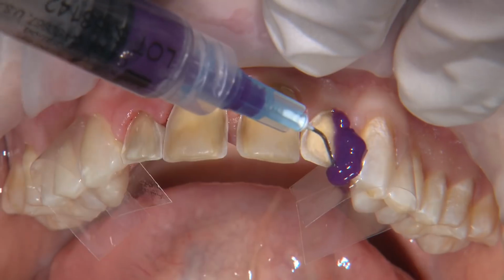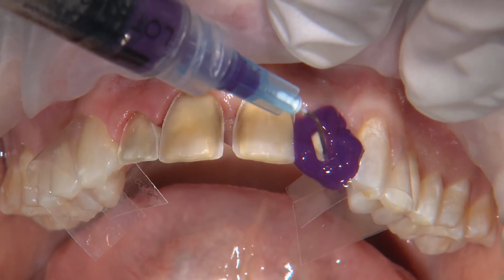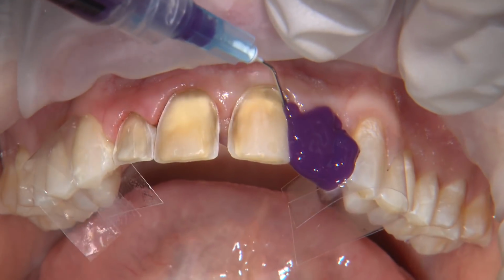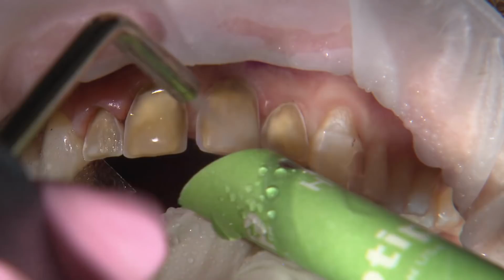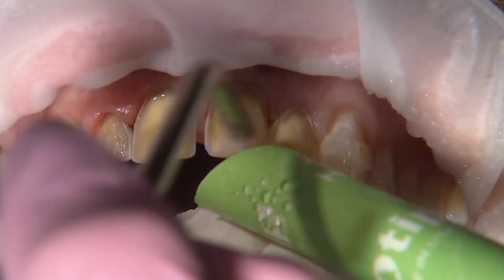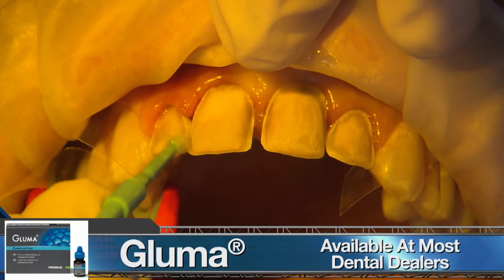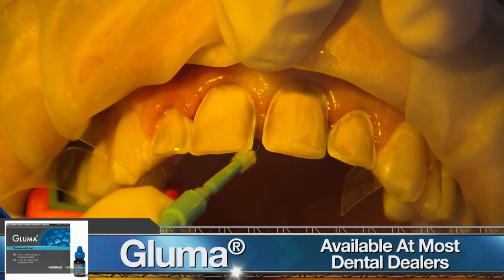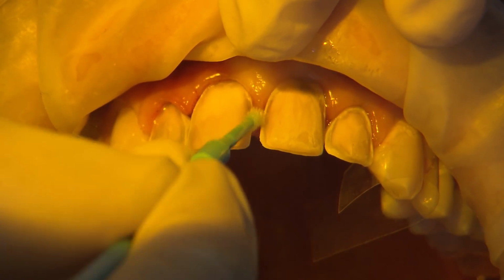For the preps, I use a total etch technique to maximize the bond of these veneers. I first protect the canines with a clear mylar strip and then apply 37% phosphoric acid on all of the preps for about 20 seconds. Next, I apply a thin layer of Gluma desensitizing agent to all of the preps and allow that to sit for at least a minute, and then aspirate any excess.